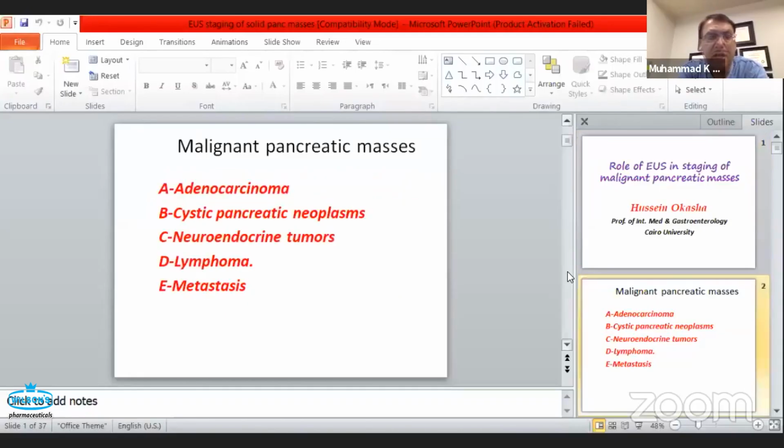And now the question comes, if you go into the pancreatic duct, would you put a stent in there? From our experience, it's not that these patients don't develop pancreatitis, but we know these patients are at very low risk of developing post-ERCP pancreatitis. Routinely, I do not. There is some evidence that some of these patients may have a symptomatic improvement if you place a pancreatic stent. So routinely we do not, and if a wire goes into the pancreatic duct, I would not.